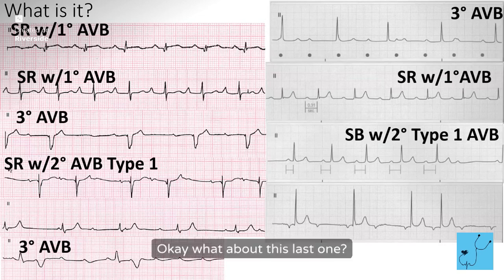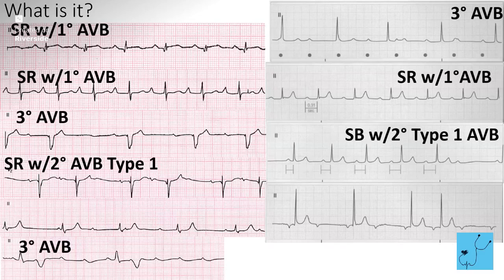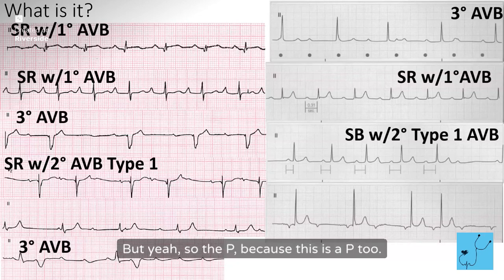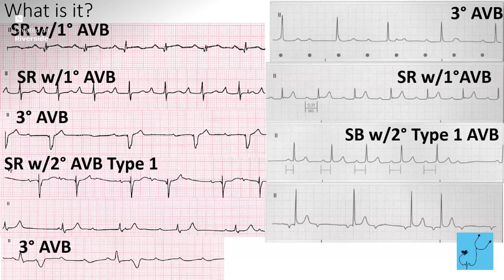Okay, what about this last one? It's junctional rhythm. Good. P's are upside down. Actually, 3rd degree. This actually looks like something we haven't talked about, but yeah, so the P, because this is a P too. This is also a P. All the P's line up.